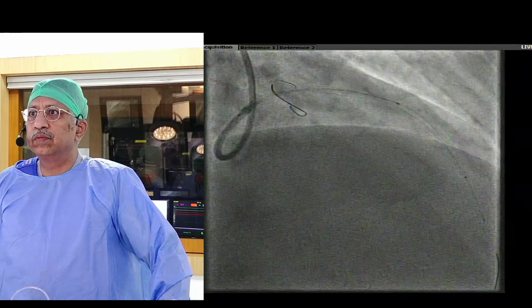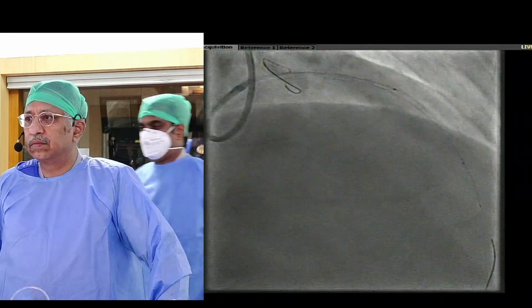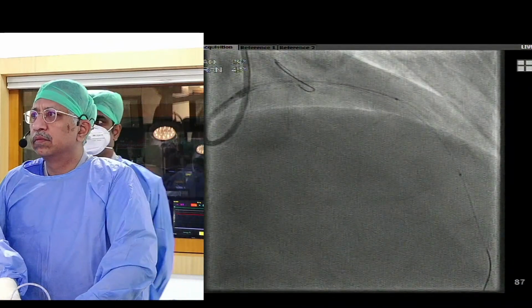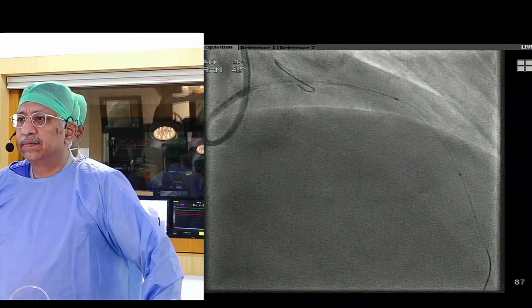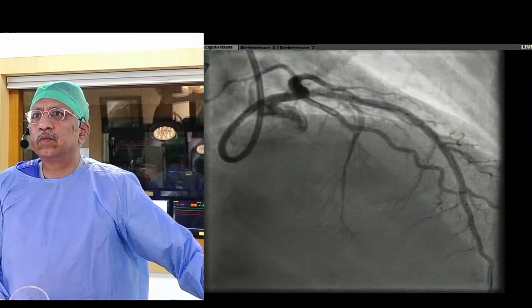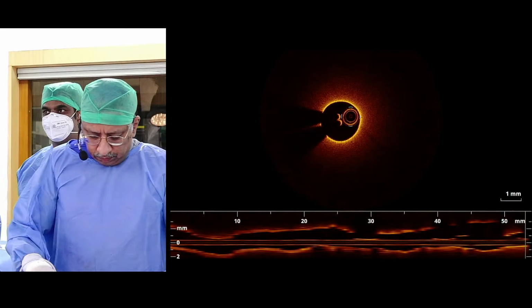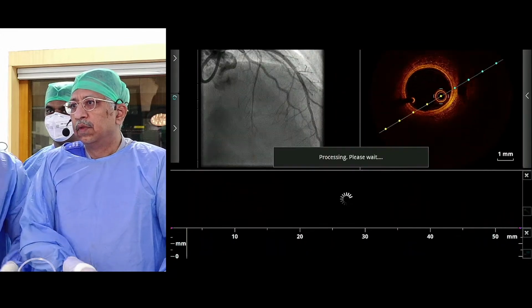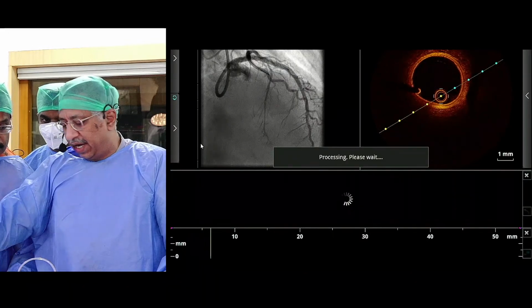But I think Ronnie's point is well taken. It's a very specific question on the crossing of the strut, so you want less spacing. But other than this, I see no application. I think strut crossing and stent fracture would be the two places that I could think that you'd really want to do this. And even fracture is difficult sometimes, right? So when I show this, you've got to go to the LAD and dilate the LAD.